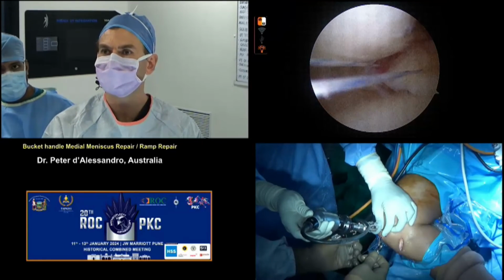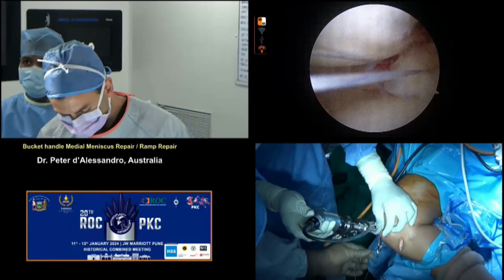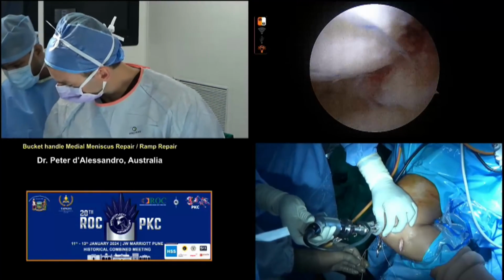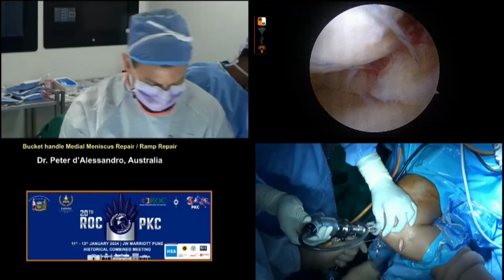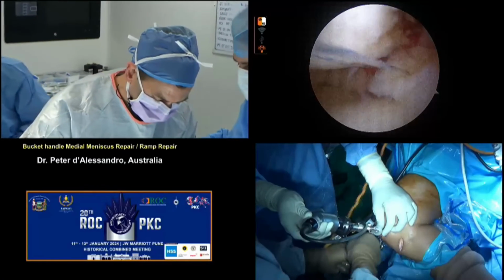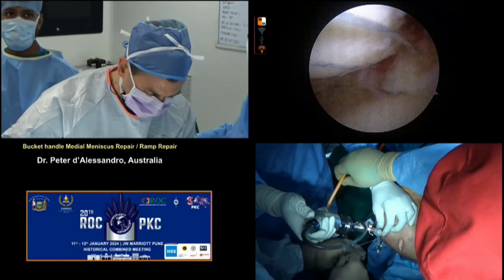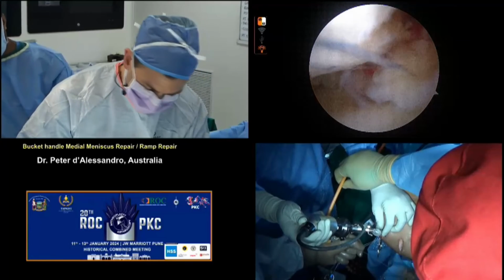So I'm seeing which one's going to be my post, and it's better reduction with that one as my post there. So we're going to artery clip, thanks. So I'll tie a slider here. How much root remnant do you need so that you can actually throw a stitch like a Nova stitch through that? Yeah, I think we're not far off the limit here.